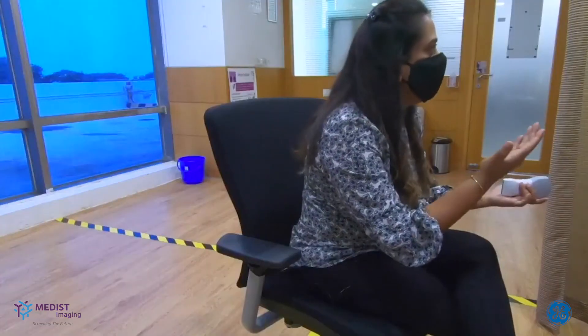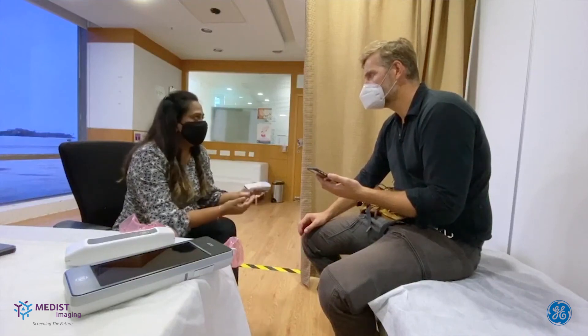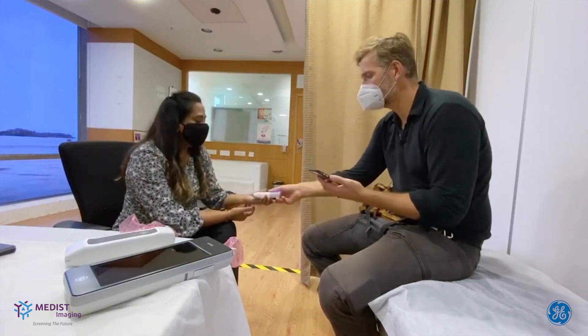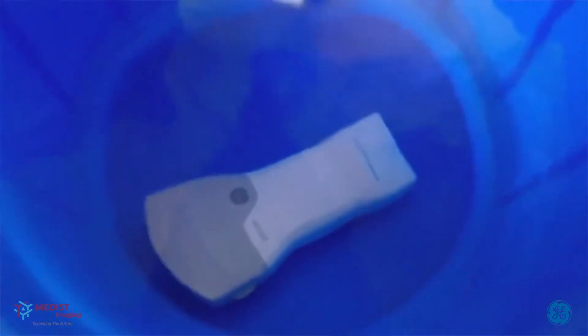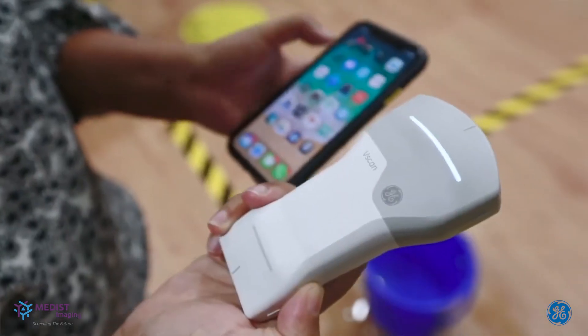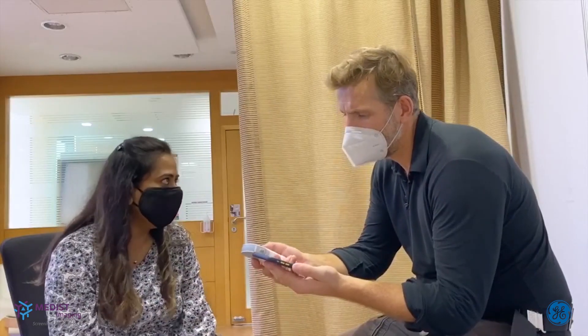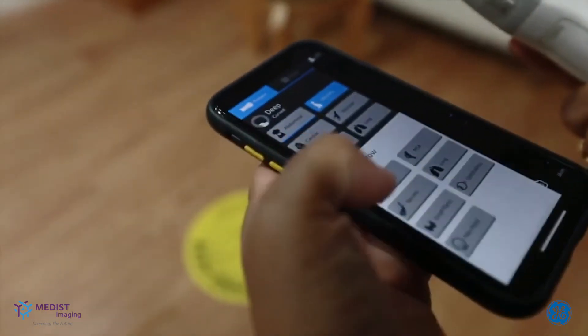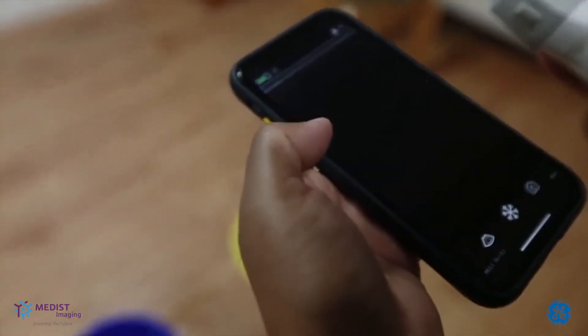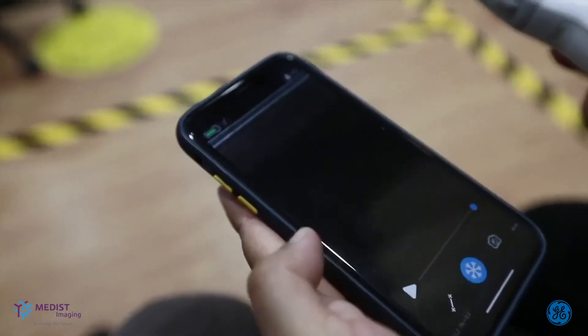It has an IP67 rating, so that means not just waterproof, but that rating also prevents dust, grime, gel, or any kind of moisture from entering. And it makes it very easy to clean, and because of this complete waterproof design, it is also very amenable to high-level disinfection. The app has been designed so that you can scan with one hand. At the same time, you're able to navigate the app with the other hand or thumb movement. Most of the primary functions are accessible with one thumb, and you should be able to operate the app with one hand.